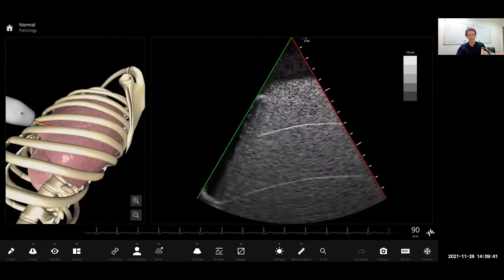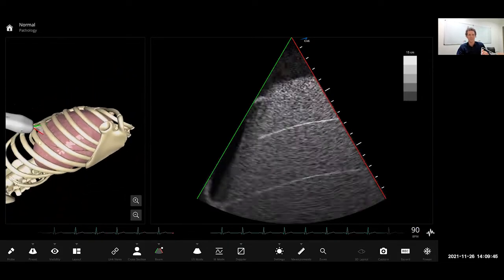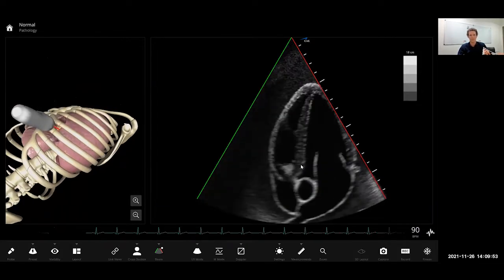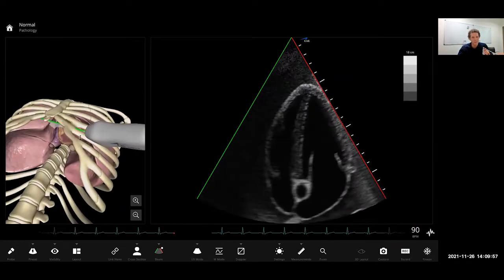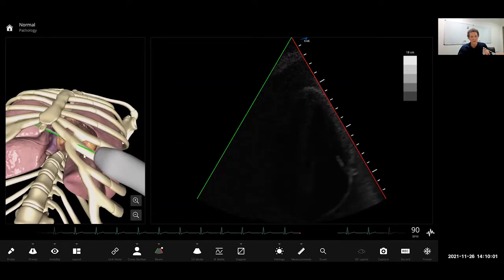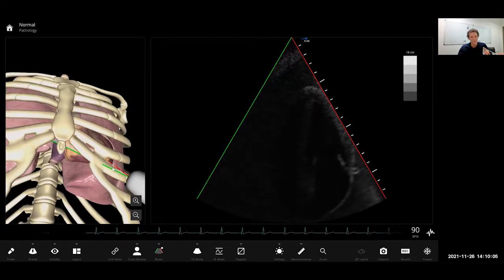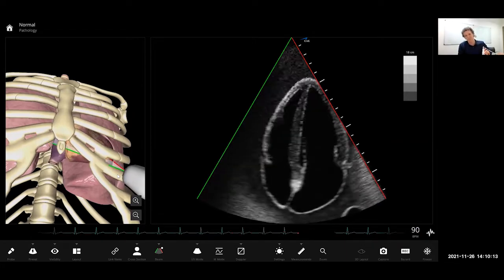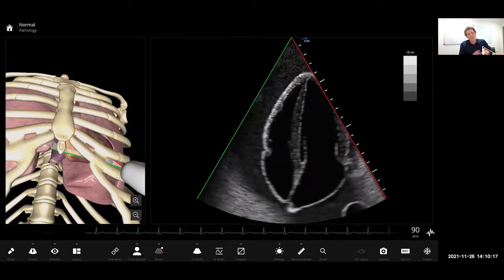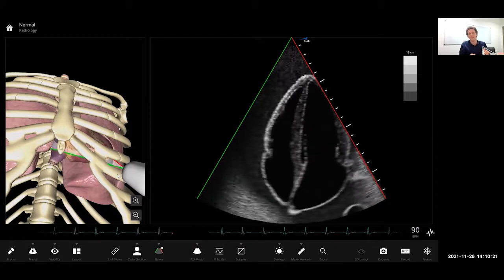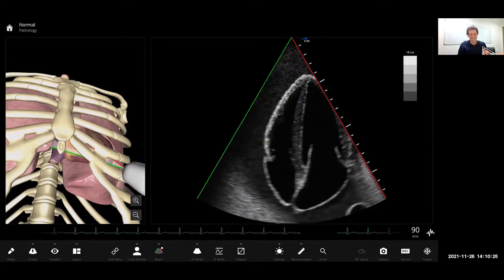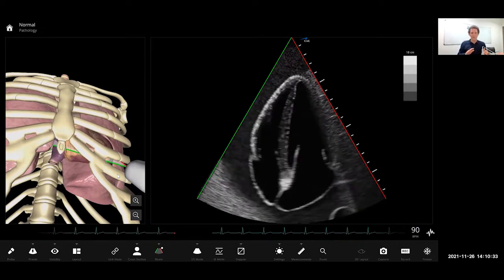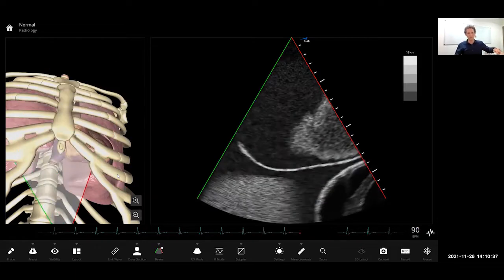With the marker pointing down towards the bed, I'll try to find my apical view. If you're on that rib, you push yourself up and almost right up and over — be careful you don't hurt anyone too much. It's about sliding off that rib space and nestling into the intercostal space. Maybe 'nestled view' is better than 'snuggly view' — I don't think I'm getting into a textbook anytime soon — but it's about just trying to get the best contact you can with the skin.